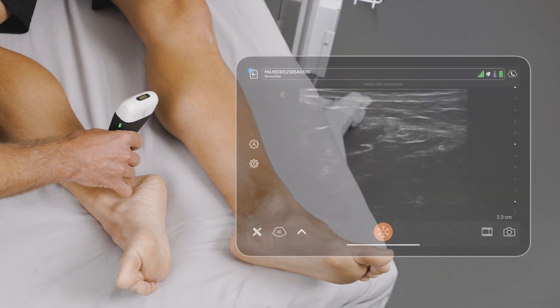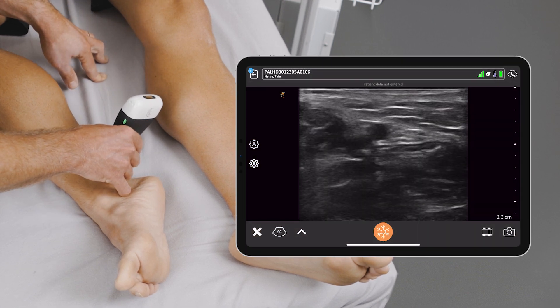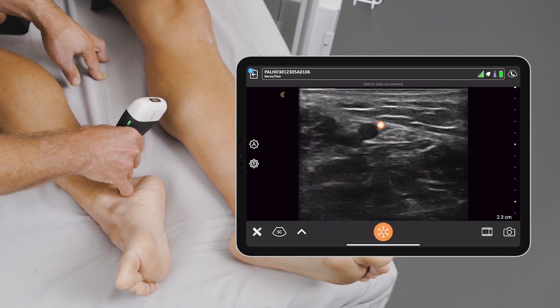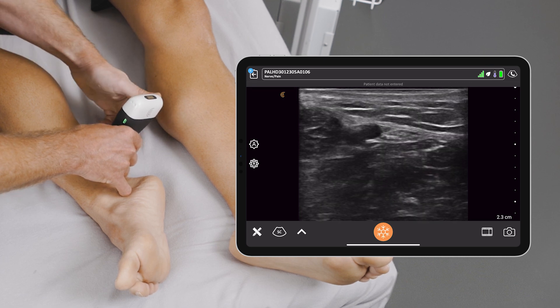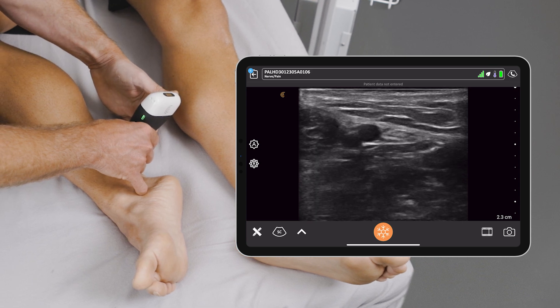My first target with imaging is the tibial artery here, which I'm going to identify as a pulsatile structure. And in most patients, the nerve will rest just posterior to that artery.